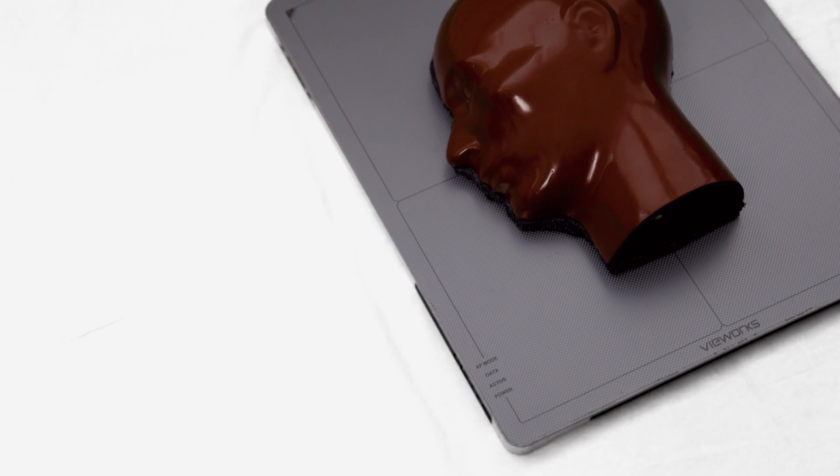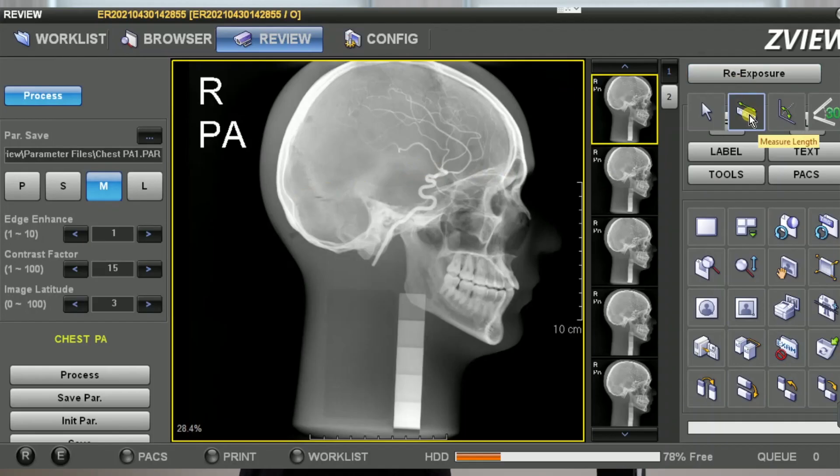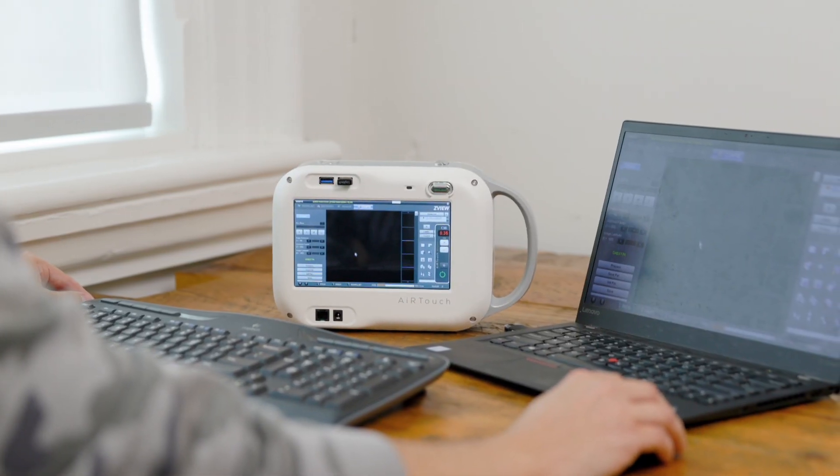Now I'm going to take you through some of their product benefits. What makes Europa so unique? Unlike any other portable x-ray machines, Europa can acquire images directly to the device, allowing operators to review the image first and then wirelessly transmit to a review PC via the built-in workstation.